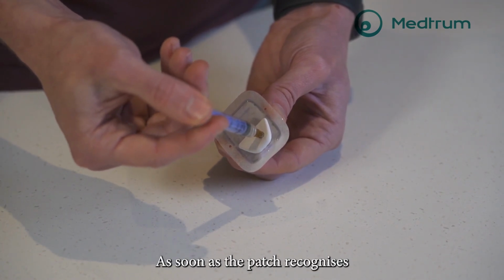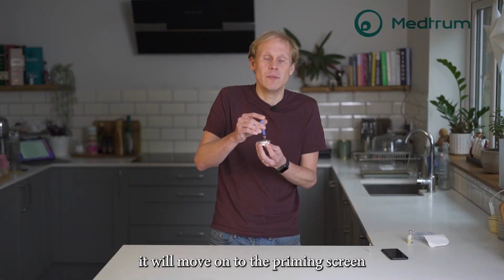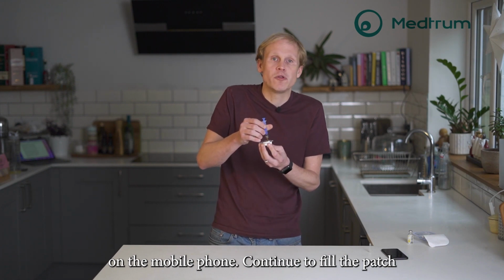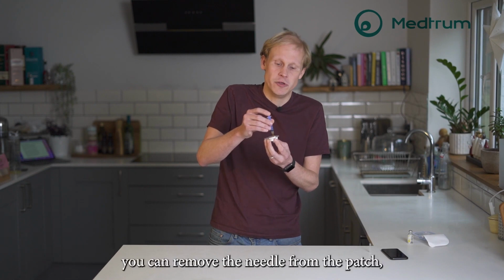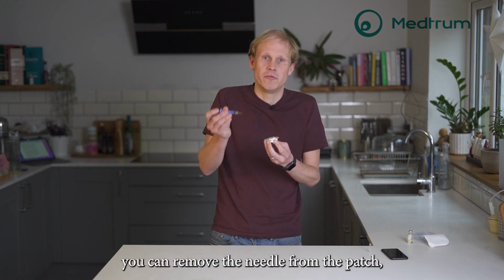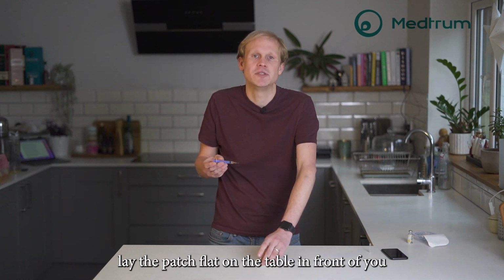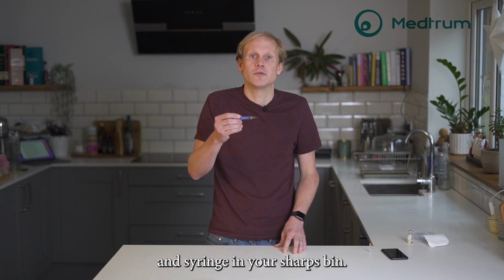As soon as the patch recognises that it's got 70 units of insulin left inside the patch, it will move on to the priming screen on the mobile phone. Continue to fill the patch with the insulin to your desired amount. Once that's done, you can remove the needle from the patch, lay the patch flat on the table in front of you, and then you'll dispose of your needle and syringe in your sharps bin.